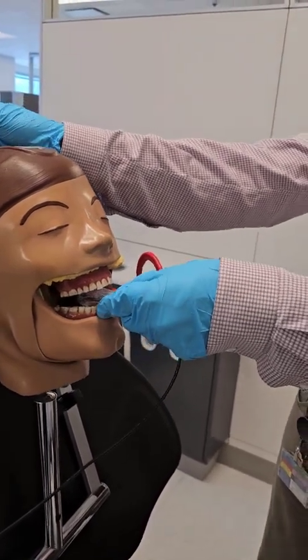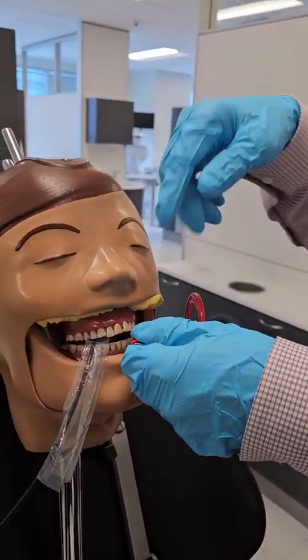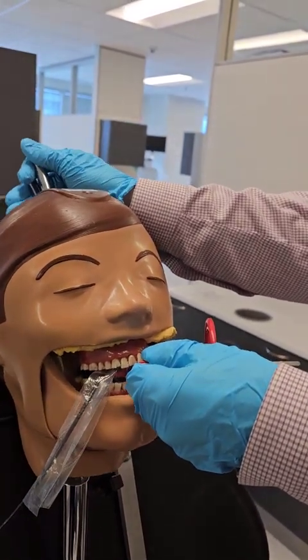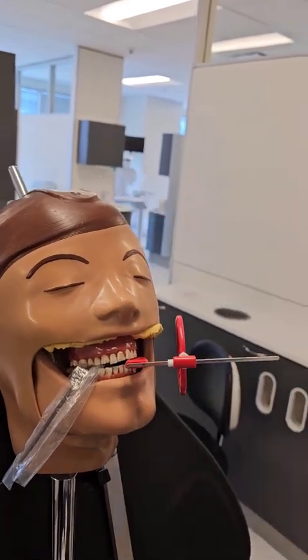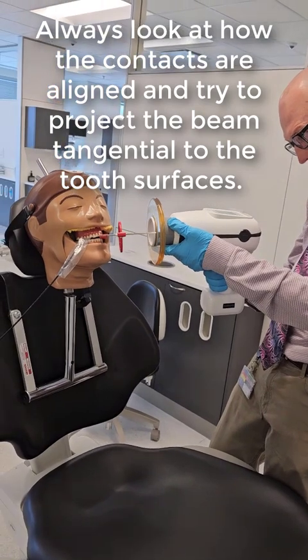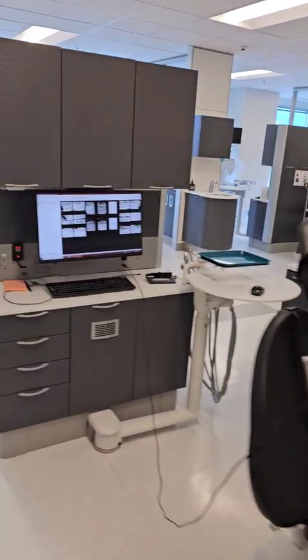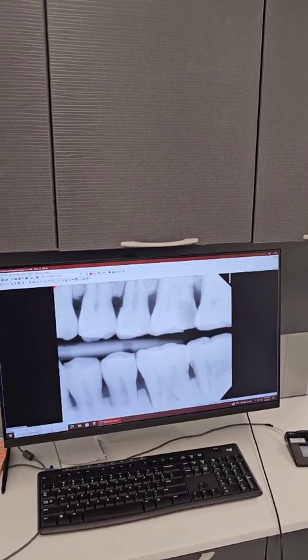I'm going to line it up for premolars, so as much as I can, I have those premolars in the middle. But you are going to be limited with how far anterior you can pull it, and some of it's just done by angulating in the opposite direction. Notice how I'm holding it against the maxillary teeth — I like doing that, and then they can bite right into it without moving it much. That's centered roughly on those premolars. I'll come back a little bit because of how these contacts are aligned, and that's going to open up those contacts. Looks pretty good — I like the open contacts, and I got distal of the canines.